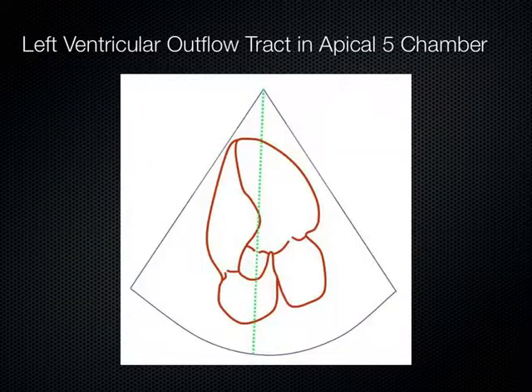Now, that left ventricular outflow tract seen in that apical 5-chamber view, this is just a schematic of it. This is where you're going to be dropping that Doppler gate right through here. And somewhere along that gate, you'll see that little TIE fighter looking thing. That's going to be just somewhere right on the edge of this aortic valve. That's where we're going to be dropping that Doppler little TIE fighter, in this general vicinity in here. And that will set us up to measure the cardiac output.